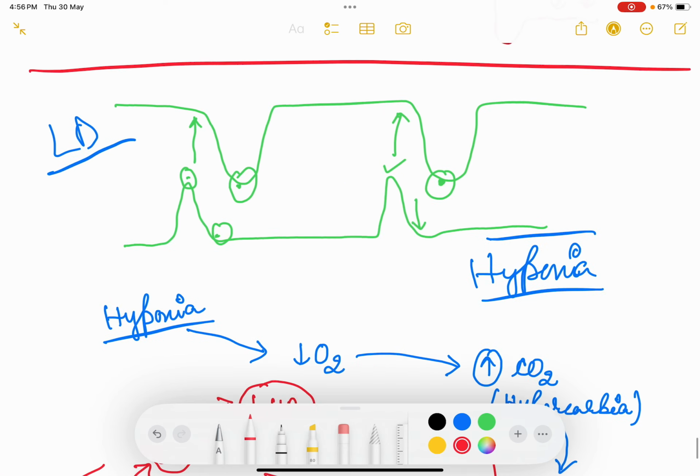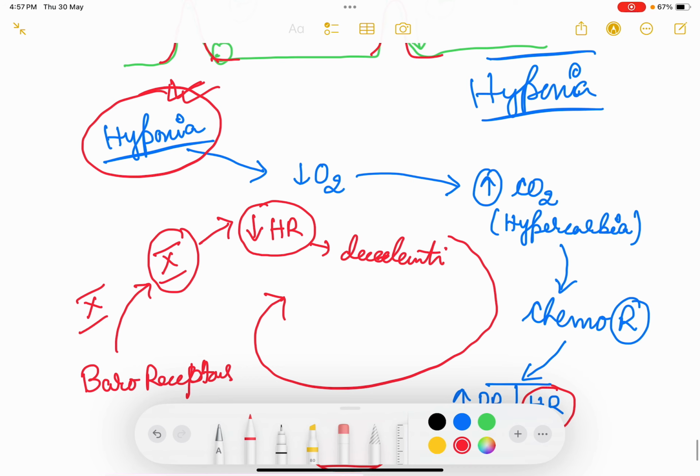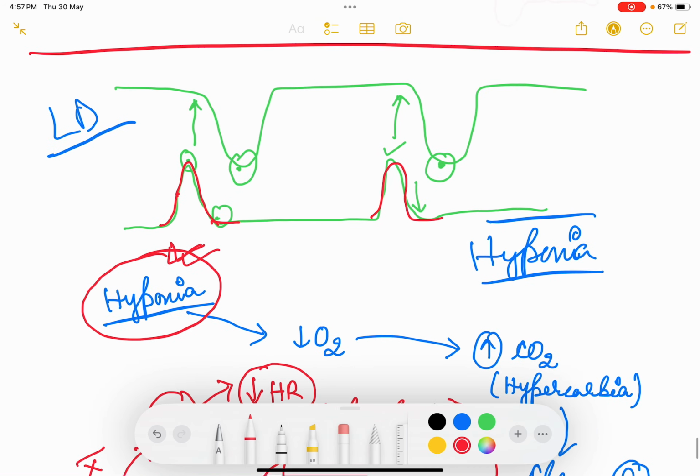That is why contractions के बाद, contractions में और ज़्यादा hypoxia हो जाएगा. अगर already hypoxia baseline है, उसके ऊपर से और contractions आ रहा है, uterus का blood supply कम हो जाएगा, then there will be more and more hypoxia and this vicious cascade takes on. So it takes a little bit of time. That is why it is a late deceleration.